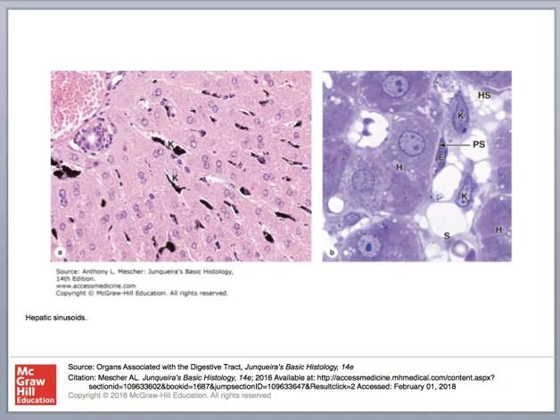There's another specialized cell that's located in the sinusoid, and these are lipid-containing myofibroblastic cells called hepatic stellate cells, and this is labeled HS in this diagram. And these numerous clear droplets are the lipid that's contained within these cells. Now these cells are important because under pathologic conditions they produce fibrosis, and we'll talk about that a little bit later on in another presentation with this case.